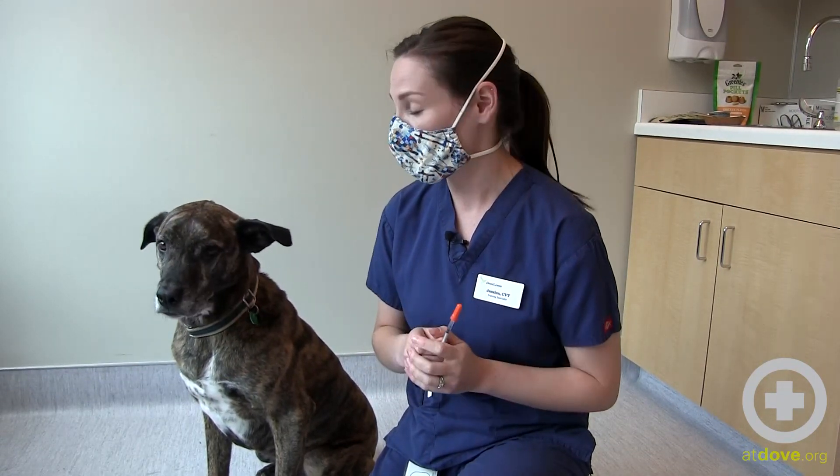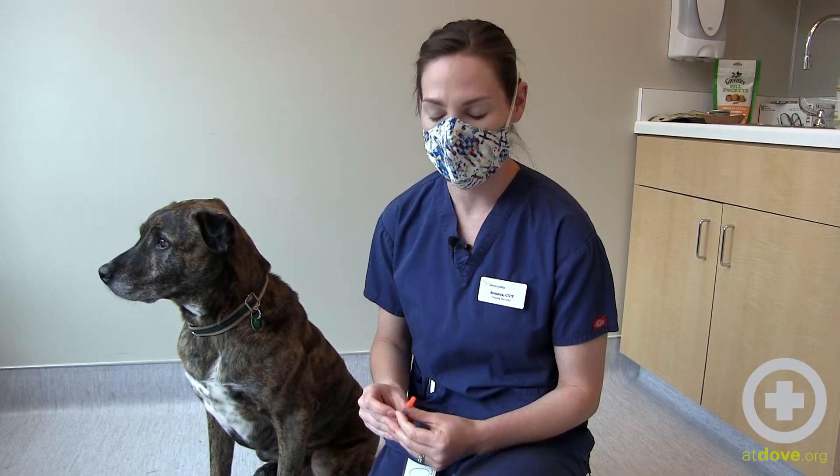He has eaten well and he's feeling good, so he is okay to have his insulin. If he had vomited or didn't eat well, I would recommend that you call your regular vet and not give the insulin until speaking with a veterinary professional.